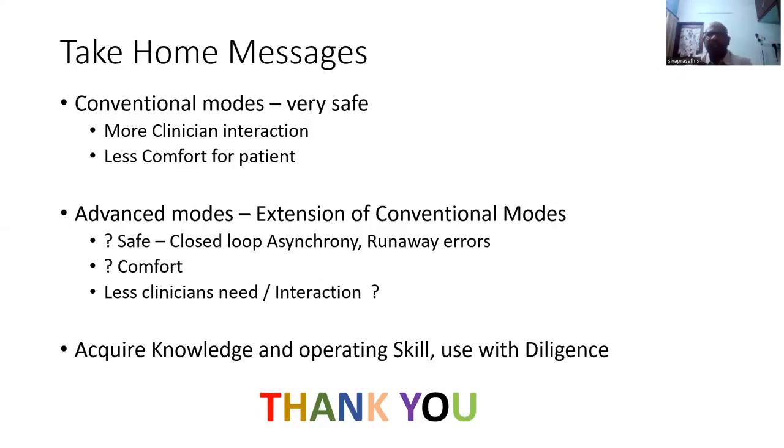So is it really safe? You have to be near it. Is it really comfortable? That you also don't know, because it's fully automatic. But definitely with the help of mathematical models and AI, it has become a little bit more comfortable. Does it really need less clinician interaction? That is also questionable. So you will have to use advanced modes with a lot of care.